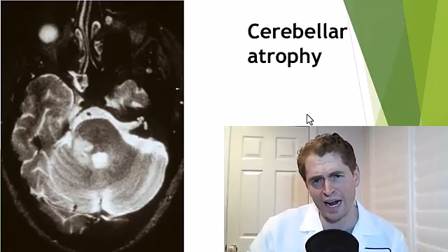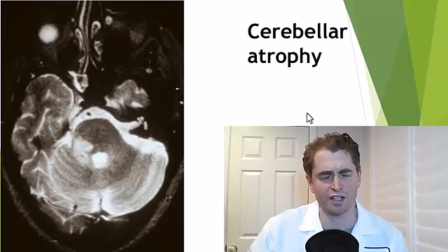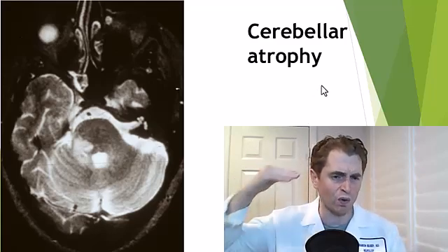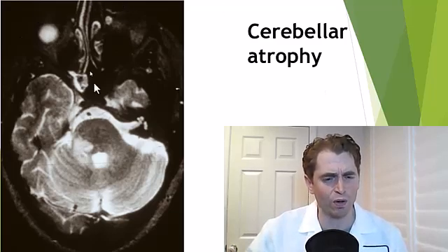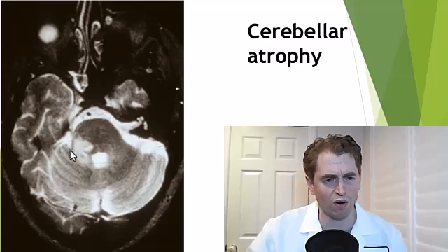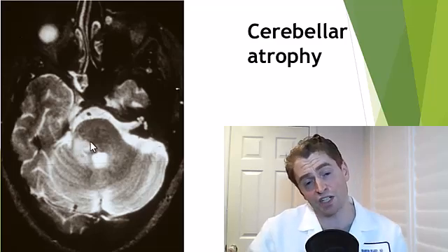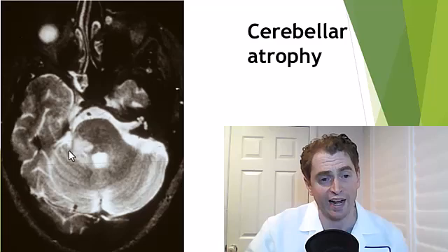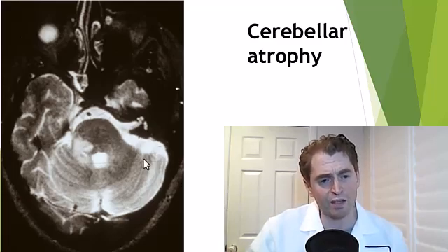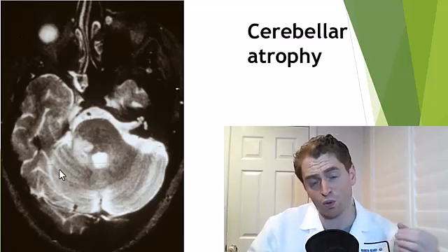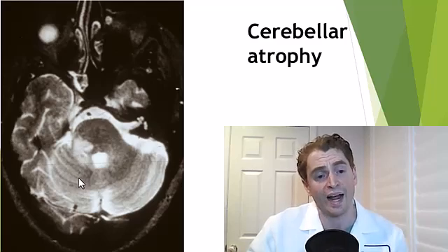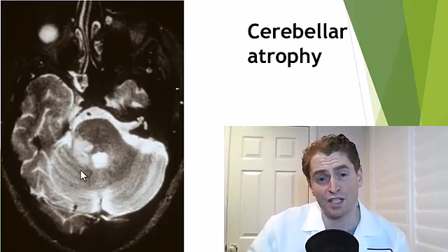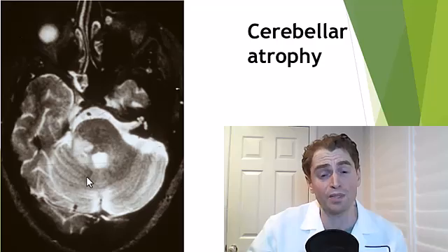Finally, there's cerebellar atrophy — shrinkage of the cerebellum. We're looking at an axial image lowered down, where you can see the nasal septum, orbits, and the pons. There's a large right middle cerebellar peduncle lesion, very typical of multiple sclerosis. The cerebellum appears shrunken — the foliae, or folds of the cerebellum, are larger and more prominent than normal. Injury to the cerebellum like this can be associated with imbalance, clumsiness, and tremor.